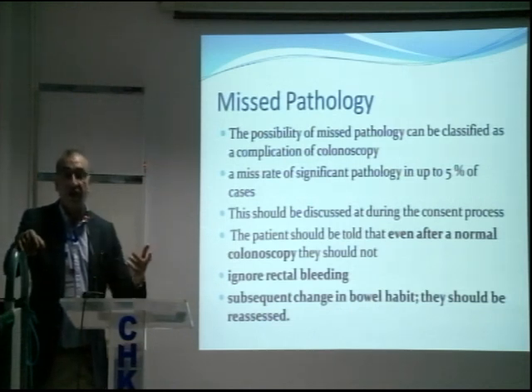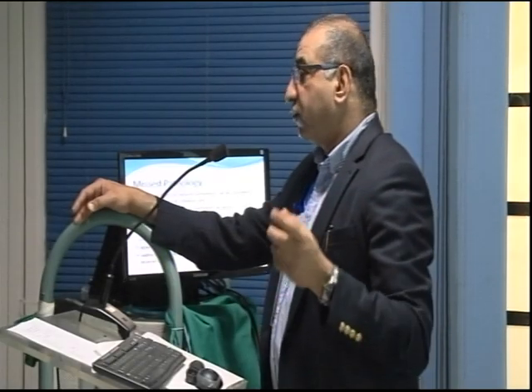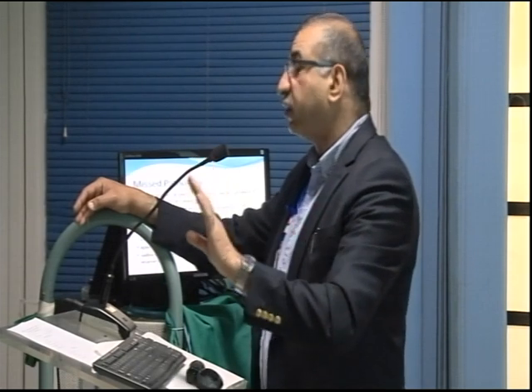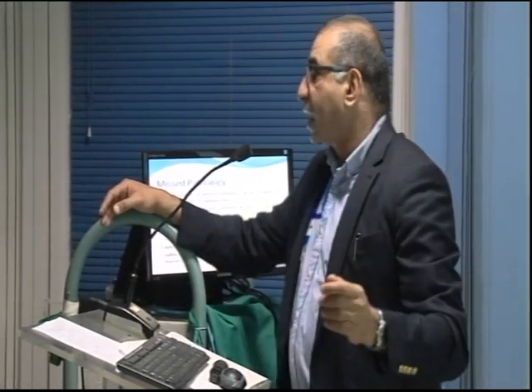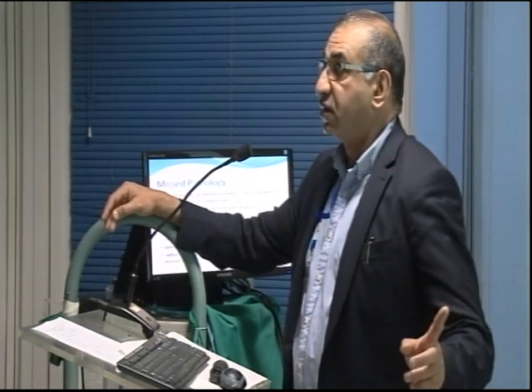That's why when Dr. Saad Nyas said, how long does it take you to take the colon out from the cecum? If you take it out in 2 minutes, you'll miss most of your polyps. If you spend at least 6 minutes or 12 minutes, some people say, you would pick up all those small flat polyps which a normal person would miss. Even in expert hands, the incidence of missing significant pathology, including colon cancer, is 5%.